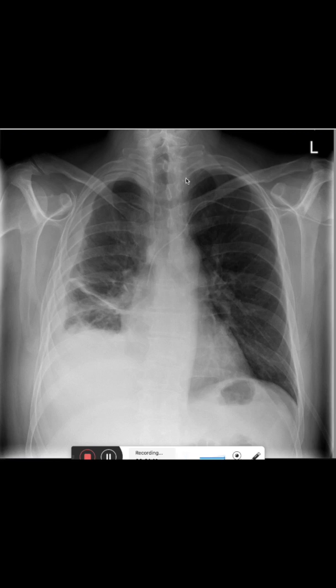We also see here the faint outline of another foreign body. This is a nasal cannula, which tells us that the patient has dyspnea.